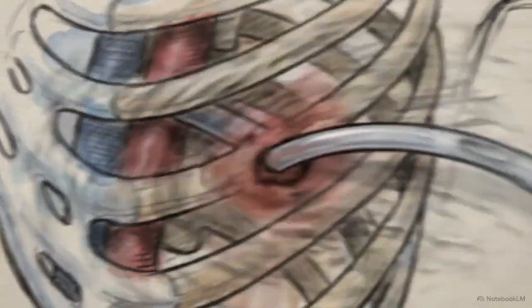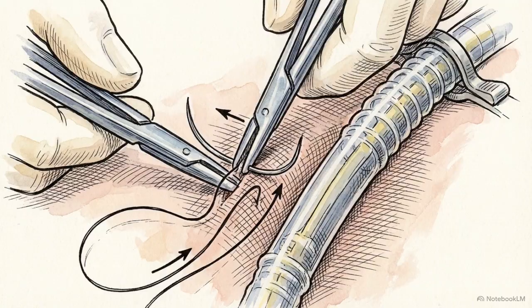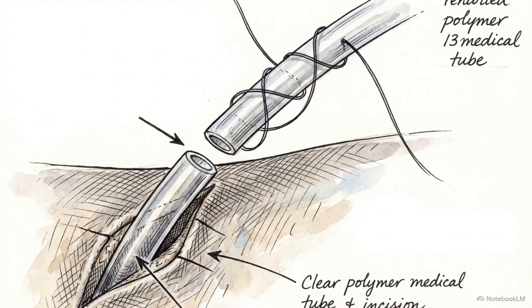A perfectly placed tube is clinically useless if it falls out of the patient. You start the closure by using a heavy zero silk suture to throw a simple interrupted or horizontal mattress stitch. You tie this down to cinch the skin tightly against the circumference of the tube, closing the wound. Traditionally, operators used a loose crisscrossing tie called a Roman sandal.